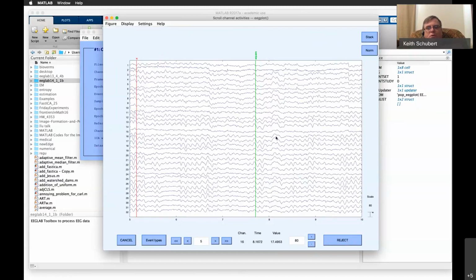Now we'll take a look at a few of these things, like right here. There doesn't seem to be as much action on channels 15 and 24. I'd be willing to bet, just given the look of those, that those are probably right just above the ear. Those tend to be very noisy channels, and if they hit it with a filter, it tends to flatten them like that. They tend to be noisy because if you move your mouth, right, that muscle connects up here.